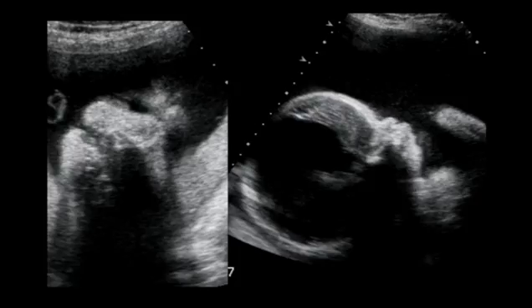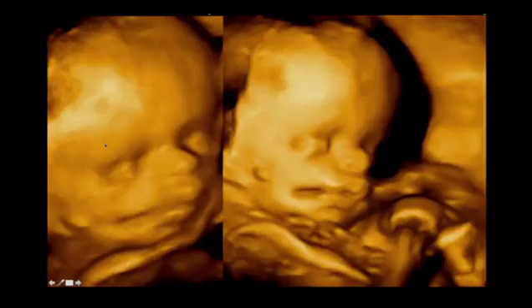Here's another fetus. You can see that there's polyhydramnios. You can even see that there's a large fluid collection in the head. But what we're talking about here is facial clefting, and there is a very strange lateral cleft here that goes over to the side.